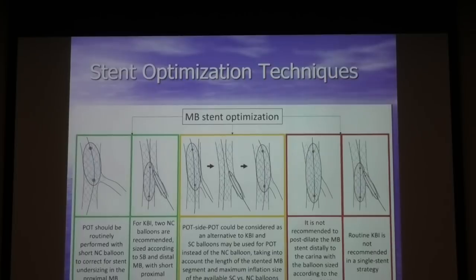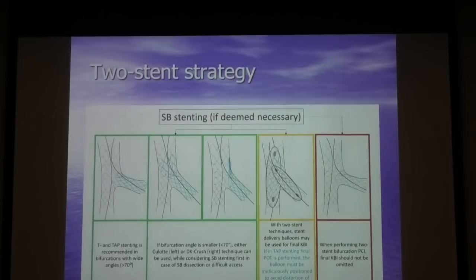One more question about bare metal stents. You know, bare metal stents, less thrombosis tendency, هذا كان بالزمانات. هلا في الوقت الحاضر we know that the drug coated stents, the second and third generation have less stent thrombosis compared to the original bare metal stents that we used to do. So the stent thrombosis issue is not valid anymore. هلا بنعطيهم عشان duration of antiplatelet, dual antiplatelet, and we have now newer generation and different design stents that you can use with a shorter duration of dual antiplatelet therapy. So in fact, the issue of bare metal stents is obsolete at this time.